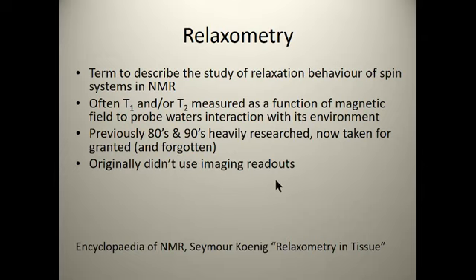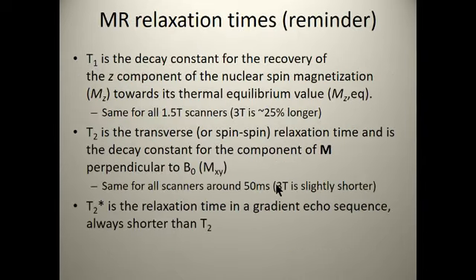Obviously, in the early days, this didn't use imaging readouts. I'd steer you towards the Encyclopedia of NMR, which is a great book, ridiculously expensive, but if your university has it online, it's excellent. And there's a great paper by Seymour Koenig in that.